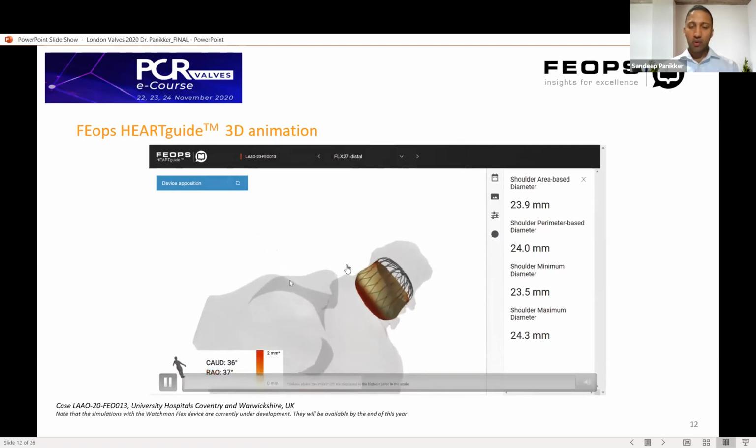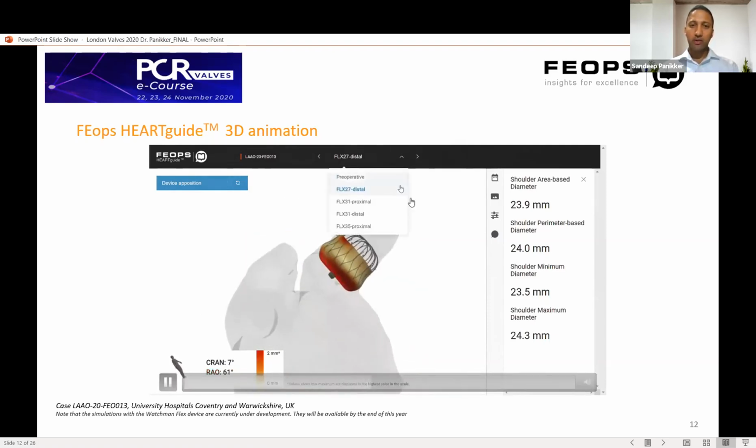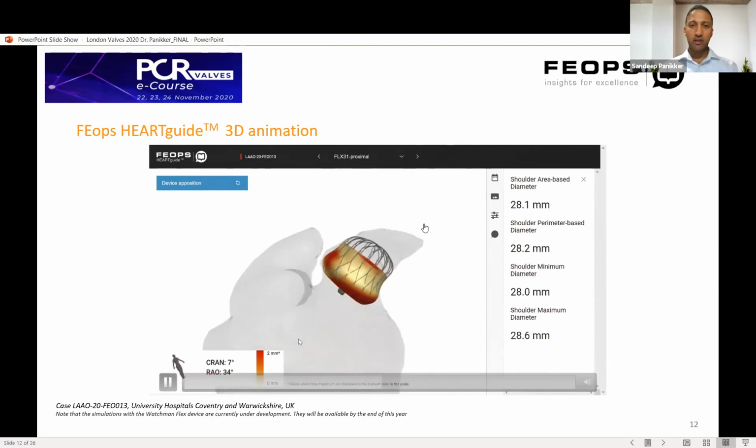So what we wanted to do was to cover that little pouch, and what you can see here is that the 31mm device was actually quite well seated, so it did cover that pouch. There was a small gap here, so it was important when we were implanting to really cover that and bolster it so that it would be wedged within that little area, so no flow could go across that. But there is a bit of a shoulder here, so that's the proximal position.